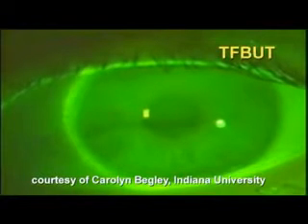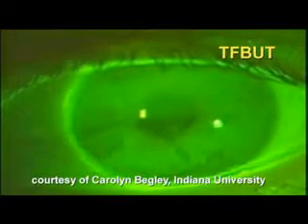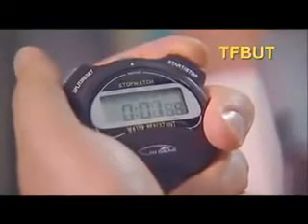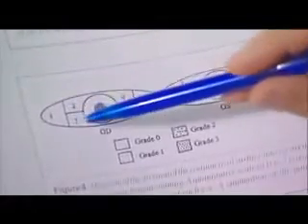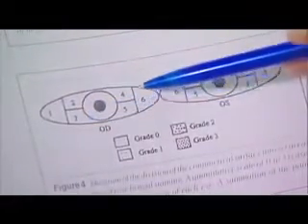The standard test for measuring tear film stability is the tear film breakup test, or TFBUT. This measures the time taken for a fluorescein-stained tear film to break down after a blink. Dye tests of ocular surface damage use grading charts to quantify the amount of staining present.